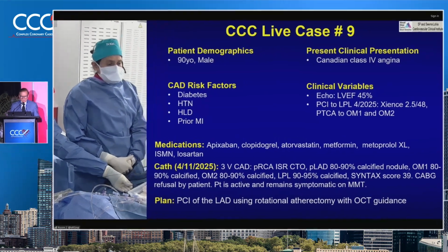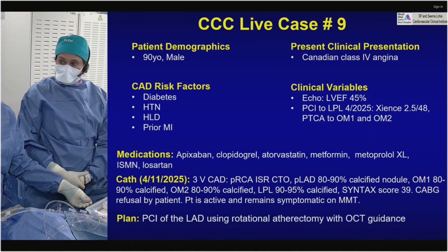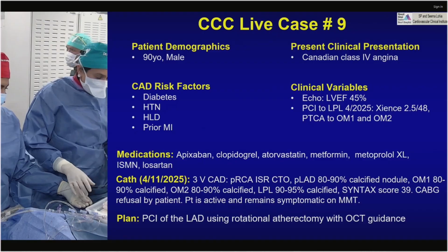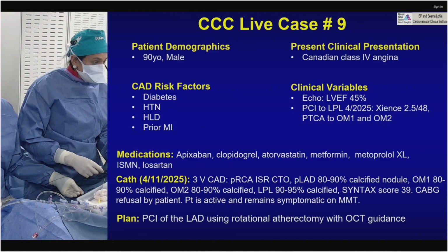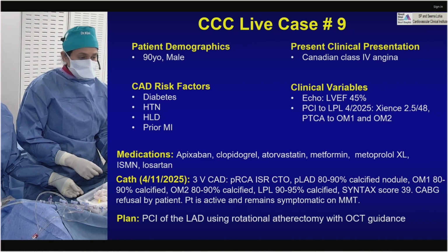So this could be the last case in this room. So we're going to introduce our staff. Where is Will? Will is the chief, I would say. He is the chief live case nurse. Every time we do a live case, he is on here. And then we have Kim and April. Yes, Peter and Asif are our techs.